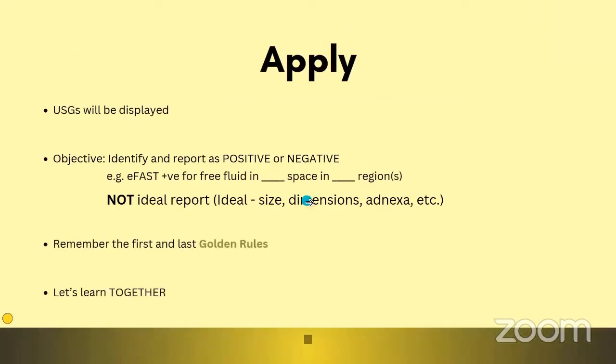Moving on. So clap for yourself. We have reached the application part. Since eFAST is more real time, there are fewer evidences and fewer files to share with you from across the internet. There are fewer open access images. So I've used a few to teach you rather than quizzing you, because ultrasonography in general is much more difficult to grasp and master when compared to chest X-ray, CT, MRI, etc. This is more dynamic, and especially eFAST.